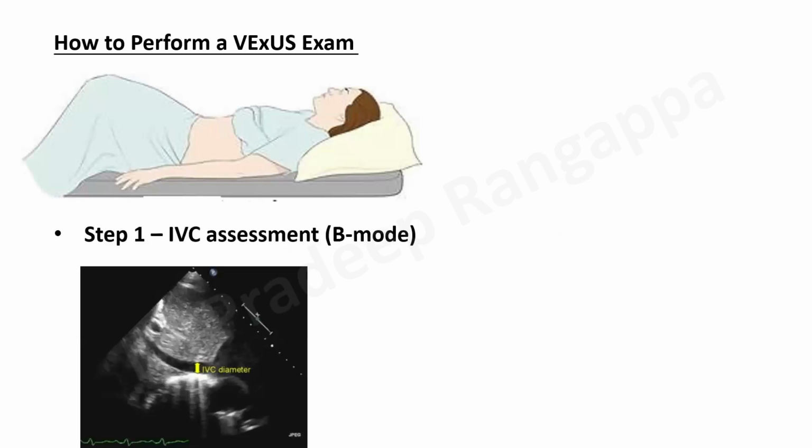Step 1 is to look at the IVC, in which I'm sure most of the ICU listeners who are listening to this are experts now.